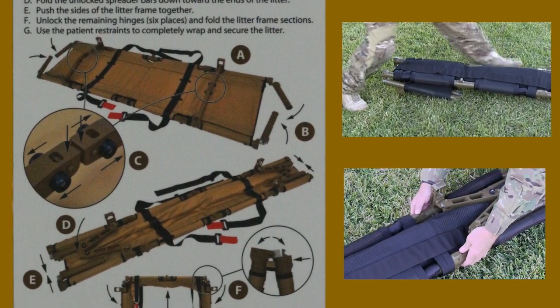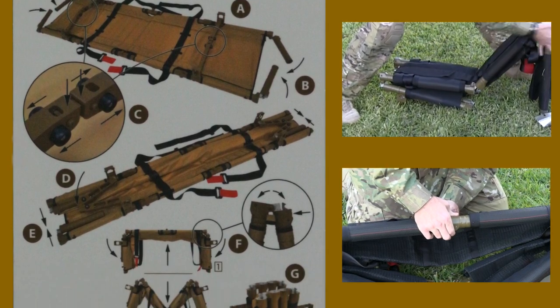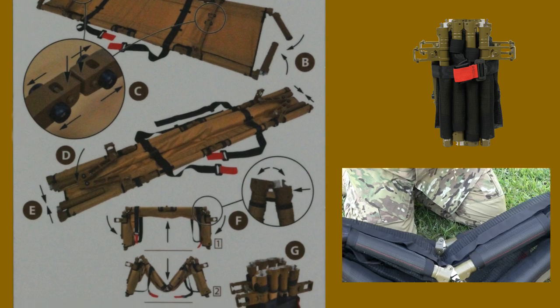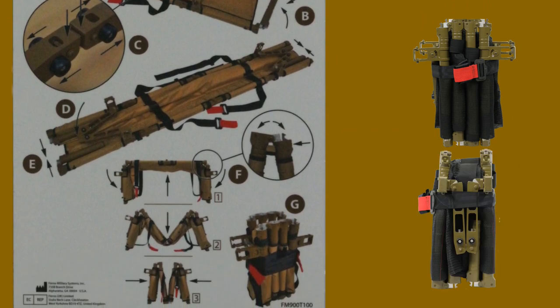D, fold the unlocked spreader bars down towards the ends of the litter. E, push the sides of the litter frame together. F, unlock the remaining hinges — six places — and fold the litter frame sections. G, use the patient restraints to completely wrap and secure the litter.